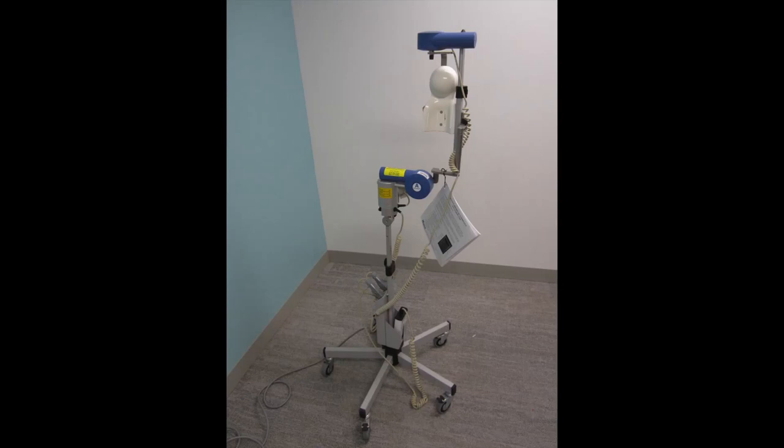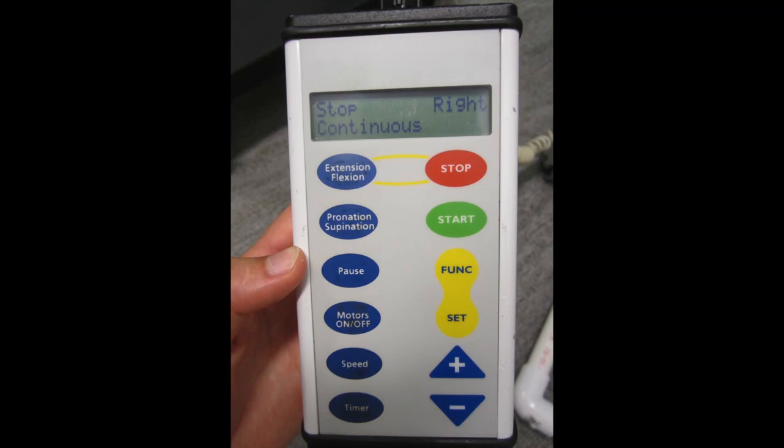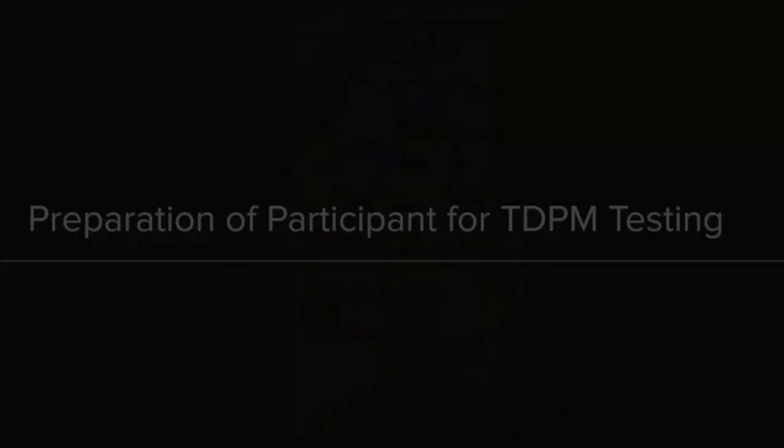Turn on the continuous passive motion machine and activate extension flexion mode. Program the CPM machine to move through 90 to 130 degrees of elbow extension at a speed of 0.23 degrees per second.